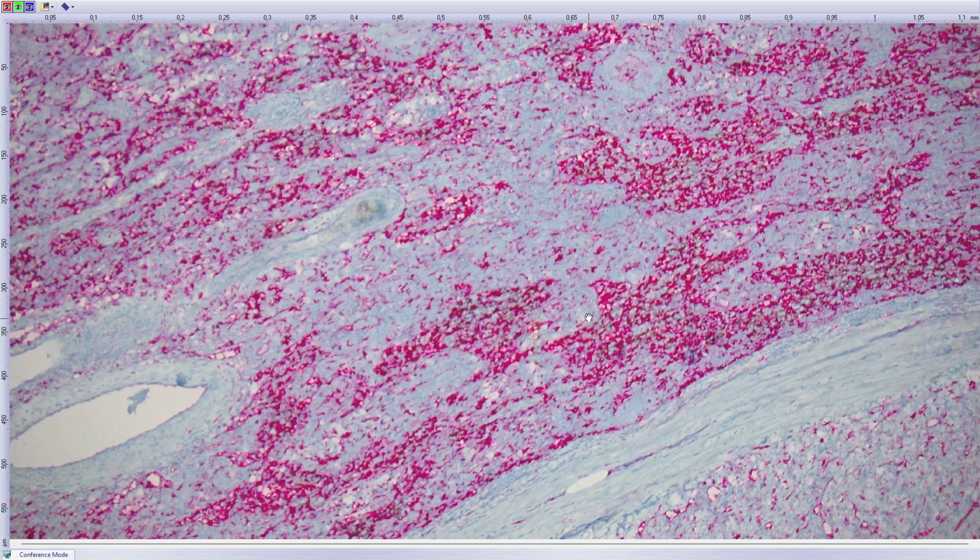Yeah, and there are other markers you can use for follicular dendritic cells. CXCL13. I learned from books. I've never heard about it before, and we actually have the marker, and it seems to be pretty diffusely positive. And then there is a bunch of non-specific stains which tend to be positive in follicular dendritic cell sarcoma, like fascin, clusterin.